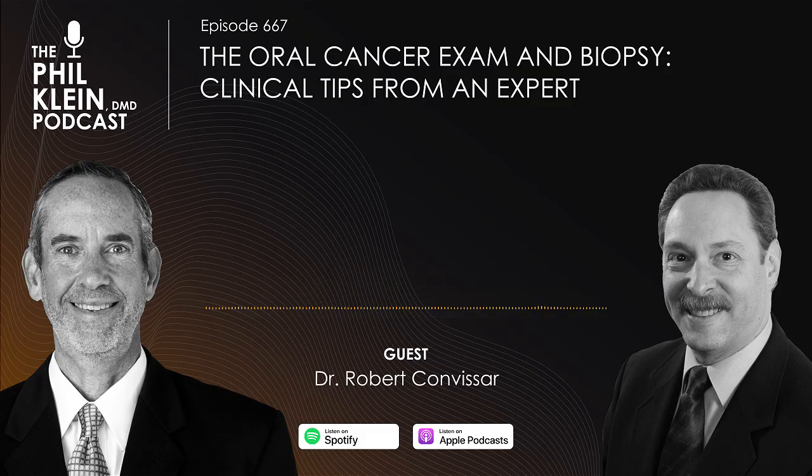Something that would be optional but highly recommended. You remember those old denture marking sticks you would use to mark denture sores? Well, those are great little things. You're looking at the lesion, you have the goggles on, you can see where the margins are, and you take these little denture sore spot marking pencils and you draw a line around where the margins are. Makes it very, very simple. Then you take your 12B blade or 15 blade or whatever, you remove it, you're all set. Simple, easy, no big deal.